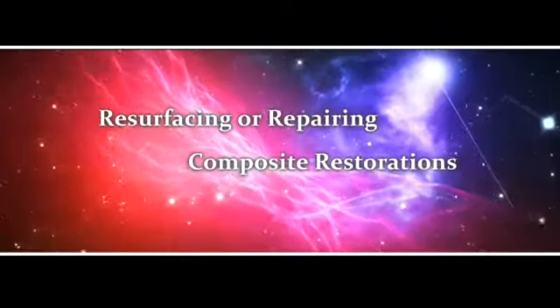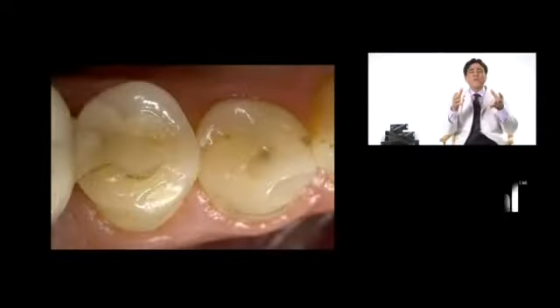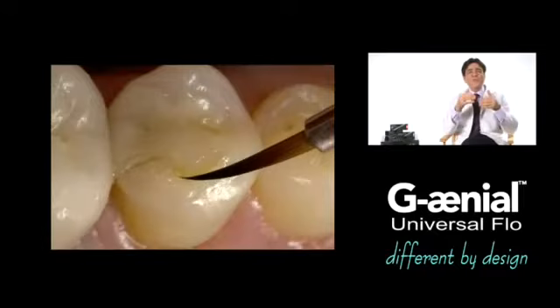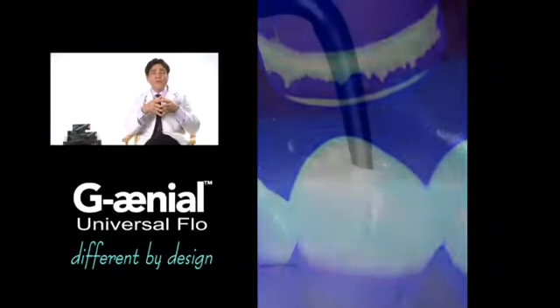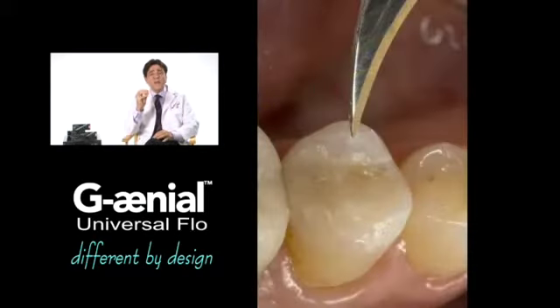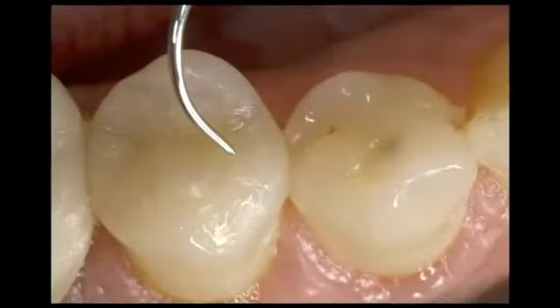To resurface or repair composite restorations, repeated flexural forces can also cause adhesive failure of adhesive restorations at the dentin resin interface, which can result in microleakage and partial or complete debonding of the restoration. A simple indirect direct technique can be used to restore anatomical morphology from wear or fracture using these next-generation flowable materials.